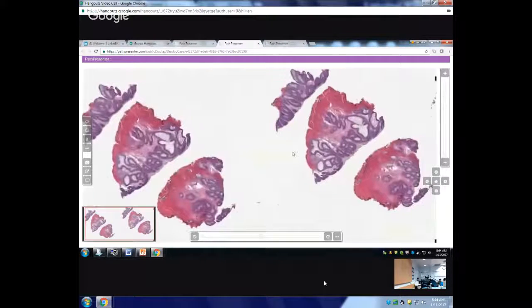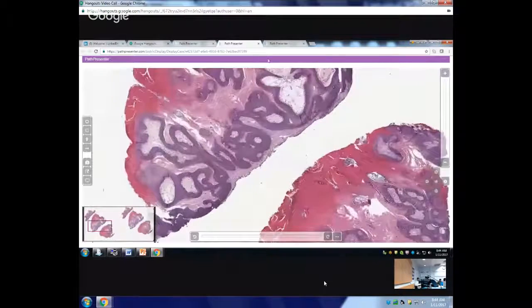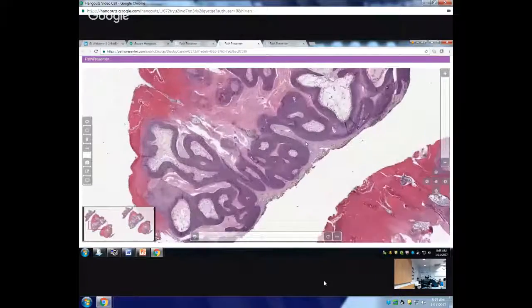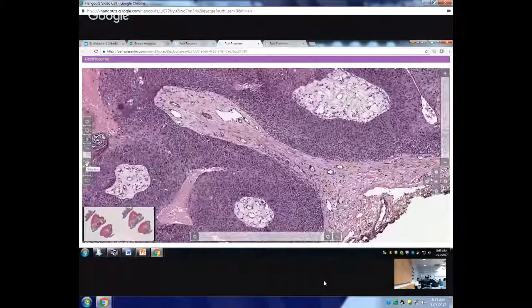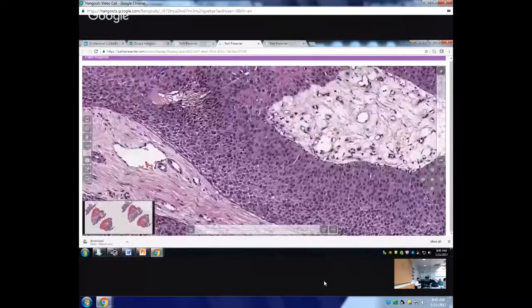So this is the same slide that you have pictures of actually. When you want to take pictures, all you need to do is go to the library, search library, pull out a slide, and if you want a picture at this power, there is a button that says camera. You see the snapshot. Just take a snapshot and you can easily take a picture. So there is a picture now. So it's easy to take a picture.